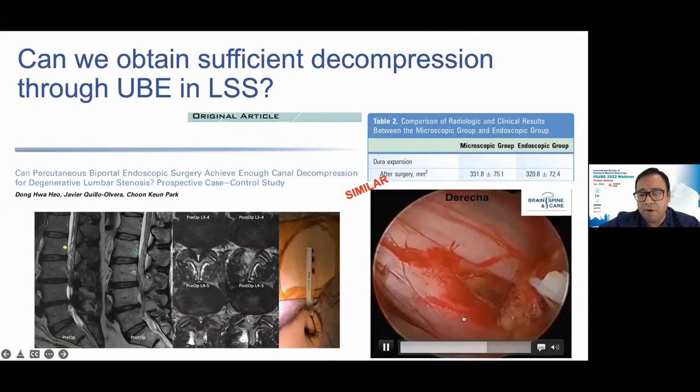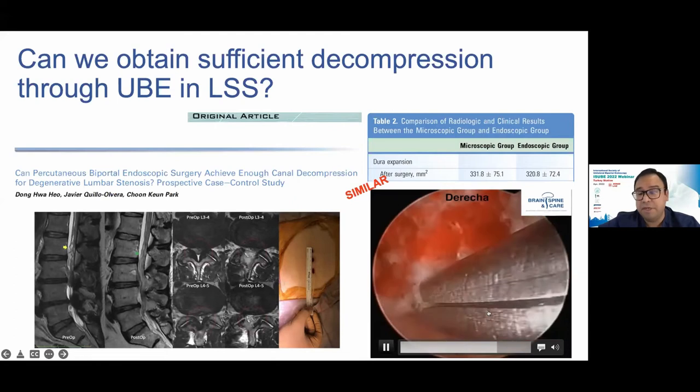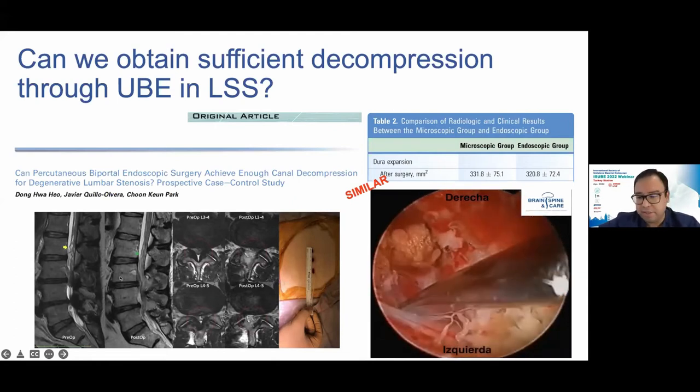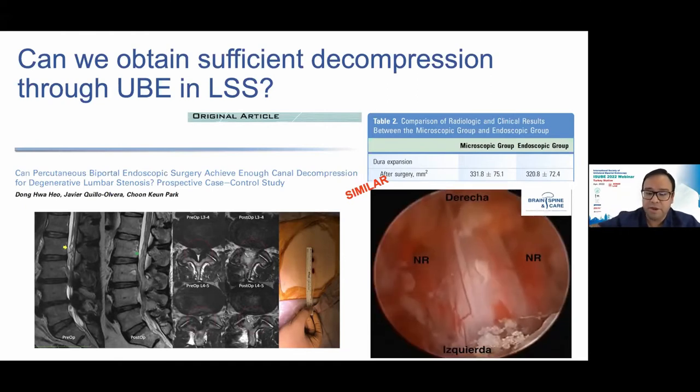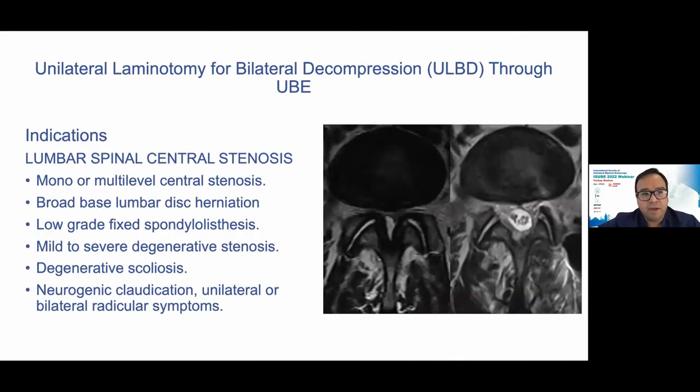In this video, I show how we can reach both traversing nerves if the case requires, in a patient with multi-level spinal stenosis, and the radiological and clinical outcomes also correlate with our surgery and with our findings during surgery regarding decompression of the neural elements. Also, with this approach, called unilateral laminotomy for bilateral decompression, or ULBD, UBE, the indications are especially lumbar central stenosis, but we can also treat mono or multi-level central stenosis, broad-based lumbar disc herniations, low-grade fixed spondylolisthesis, mild to severe degenerative stenosis, and degenerative scoliosis in some cases, if the neural elements should be decompressed. Also, patients with neurogenic claudication, unilateral or bilateral radicular symptoms can be suitable for this approach.